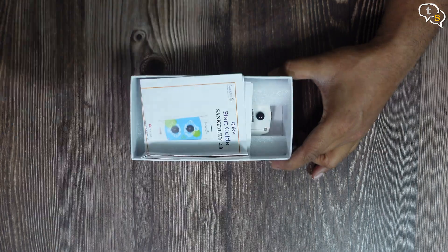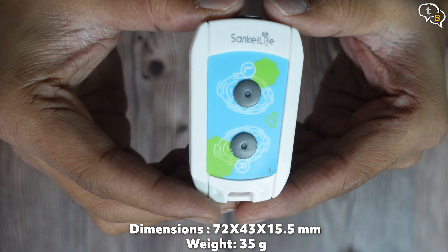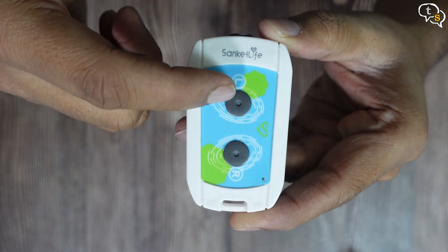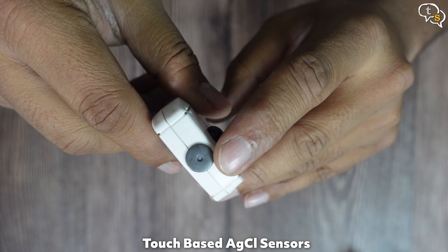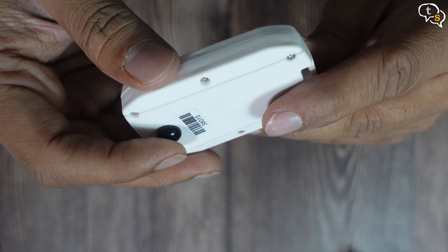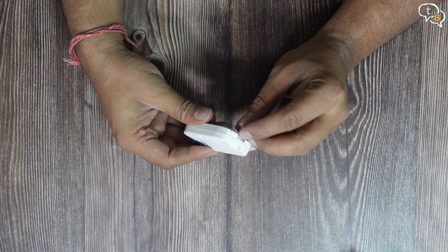The cover slides out like so. Here's the quick start guide, pictorial and quite informative. And here's the device, quite small. We have the Sanket Life logo on top, there are two sensors on the top face, they are marked L and R. We will get to why in a bit. Here's the third sensor, also called the side sensor. We have the on/off switch at the bottom, tap to turn it on or off. I think the batteries are below this cover, I will open it after I try out the device. We have a lanyard slot here.